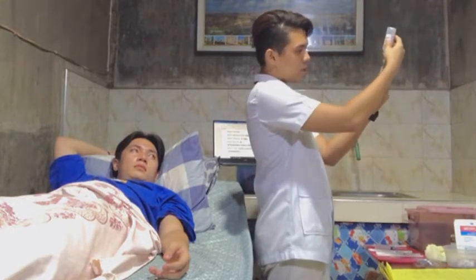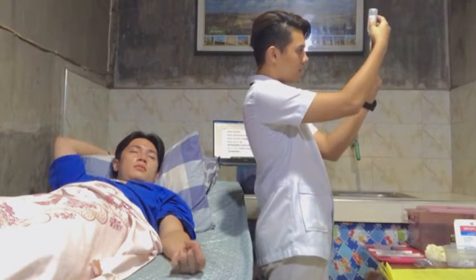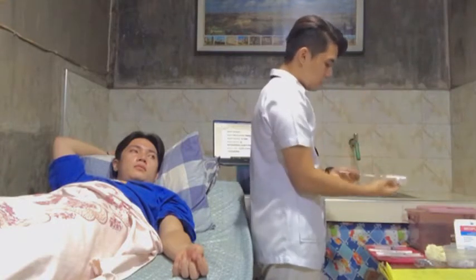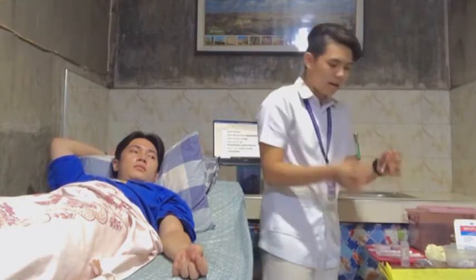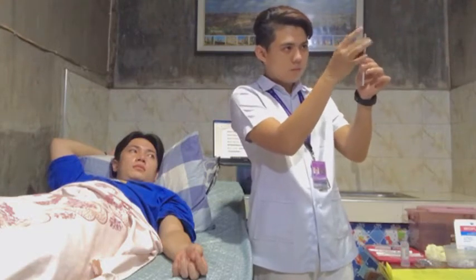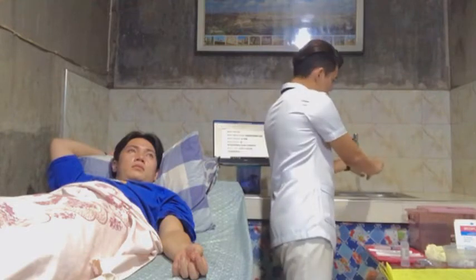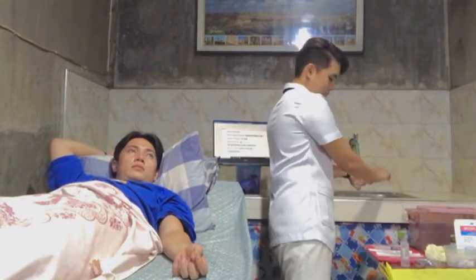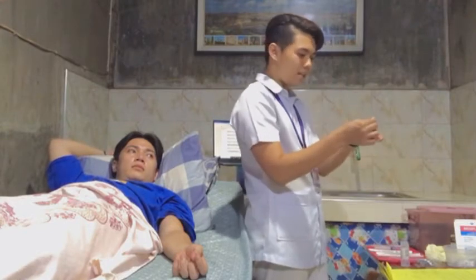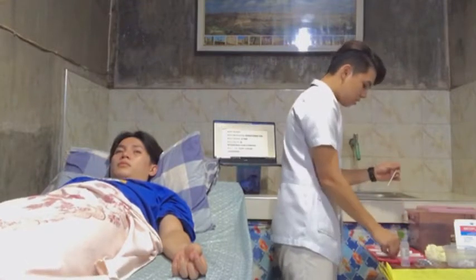So it will be 0.75 at eye level, so that you will have the right measurements. After that, for us to check, flick it here, and if there are bubbles, you just need to push them in like that. So next, change the aspirating needle to the needle gauge for the intradermal injection.